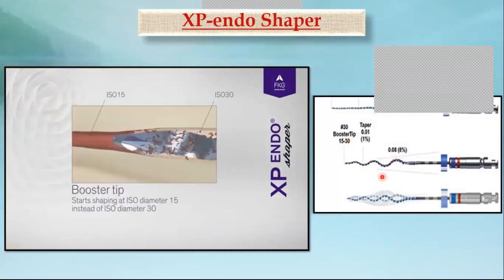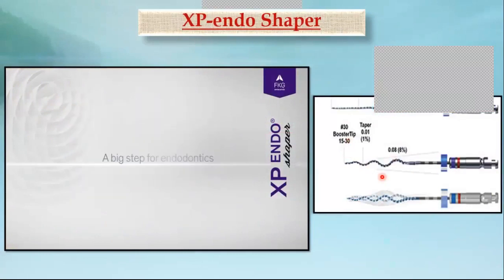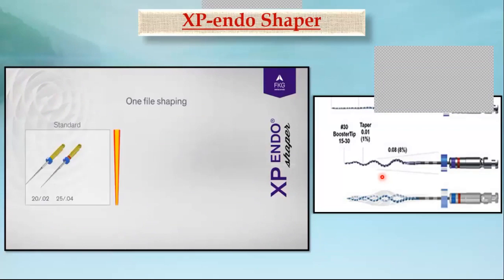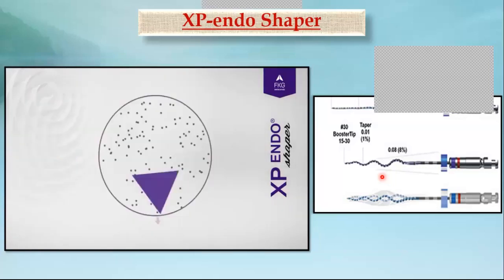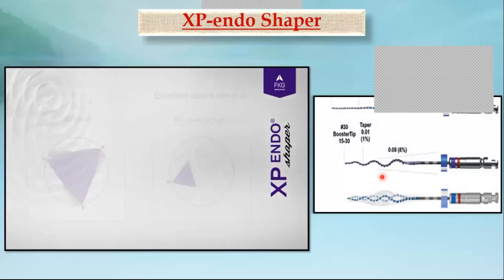When introduced inside the root canal, the temperature is elevated to body temperature. It becomes stiff enough to cut dentine and expand inside the root canal, with expansion capacity that may create tapers up to 8%, depending on the time that the file operates inside the canal. The 1% taper makes it highly flexible and highly resistant to fatigue and separation.